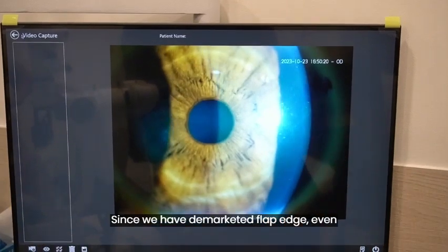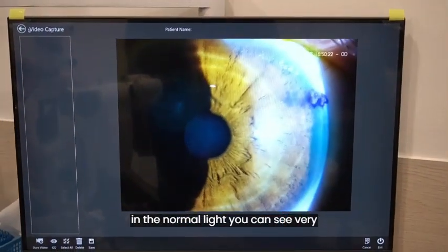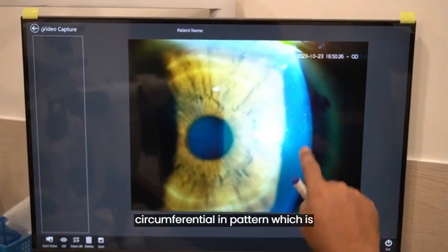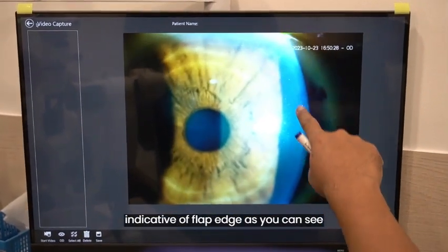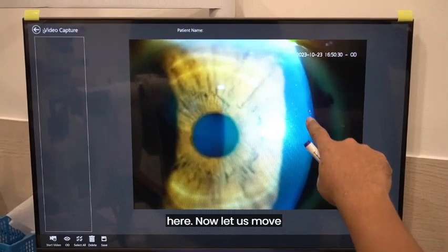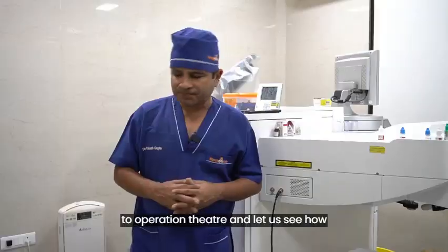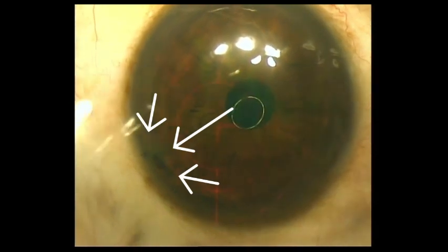Since we have demarcated the flap edge, even in normal light you can see very faintly there is a line which is circumferential in pattern, which is indicative of the flap edge as you can see here. Now let us move to the procedure and see how to lift this flap.